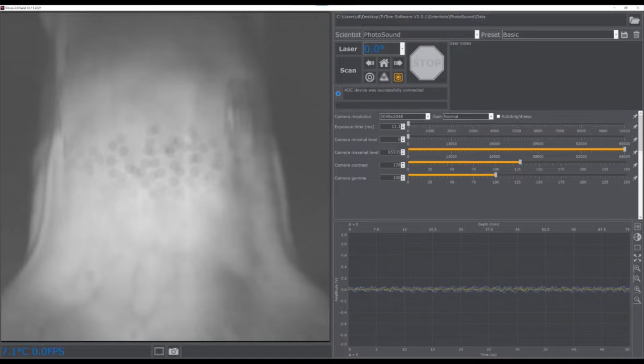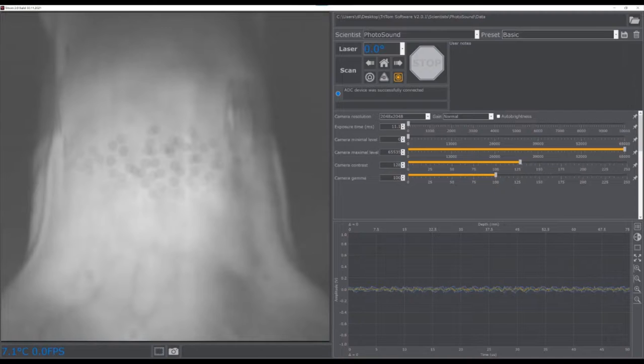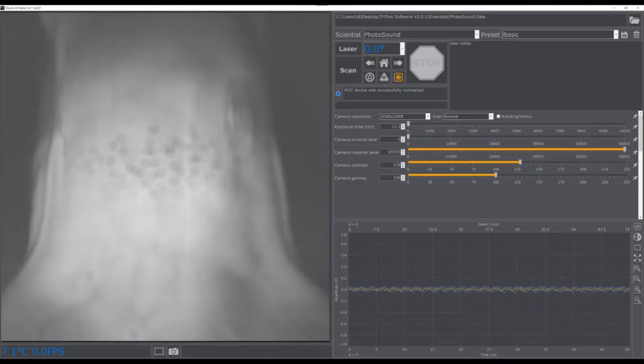To the right of the laser settings menu are the camera settings, which include options for the resolution gain, an auto-brightness function, and various other features for optimizing the optical data.